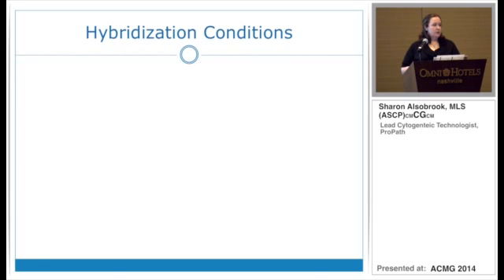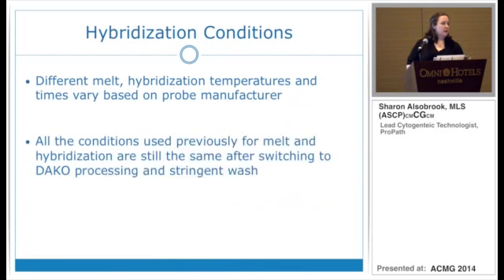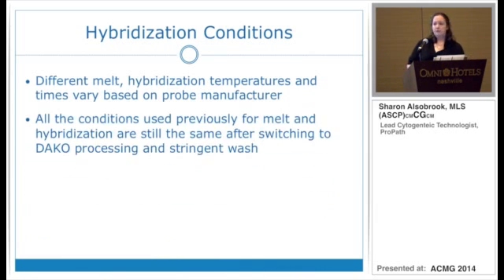When you're looking at other probes besides HER2, which is the FDA protocol, so we have to follow it step by step, when you have other probes involved, you have to, again, look at how you optimize that specific melt temperature and melt time, hybridization temperature, hybridization time, generally overnight. Even though we changed the way we process the specimens to have them ready for probing, we didn't change the melt or hybridization conditions of any of the probes.